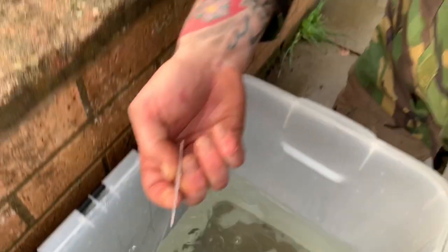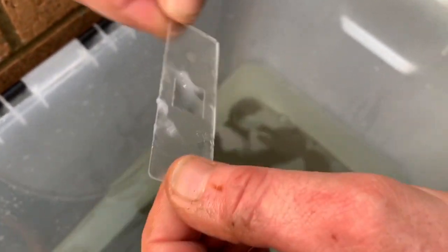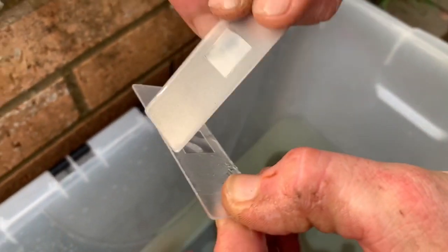Well done. Okay, so as you can see on the slide here, quite a bit of mucus, and what we're going to do is put it between these two, lay it flat, and then we'll take it over to the microscope and have a little look. As you see, this little fella's fine, wondering what's happening. We've just pressed them together and that'll go straight to the microscope.